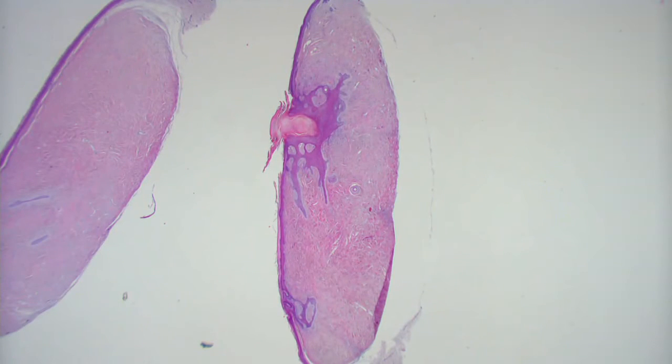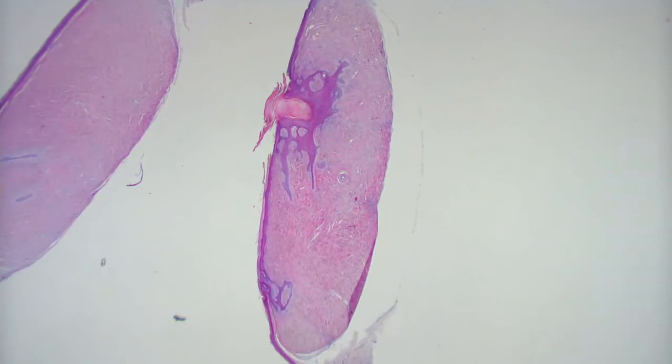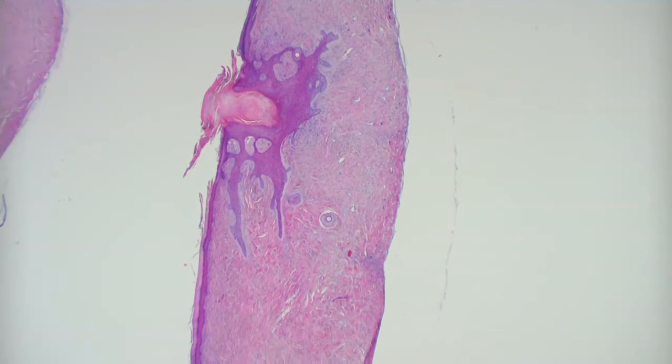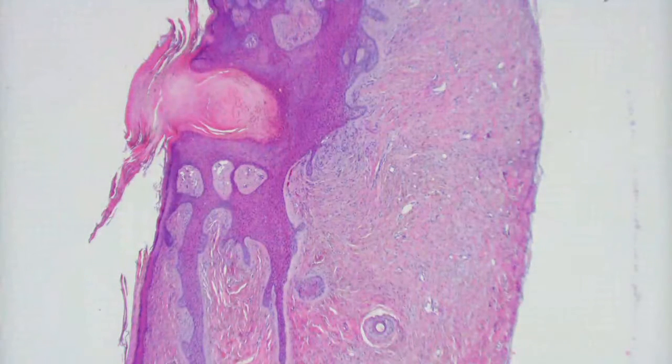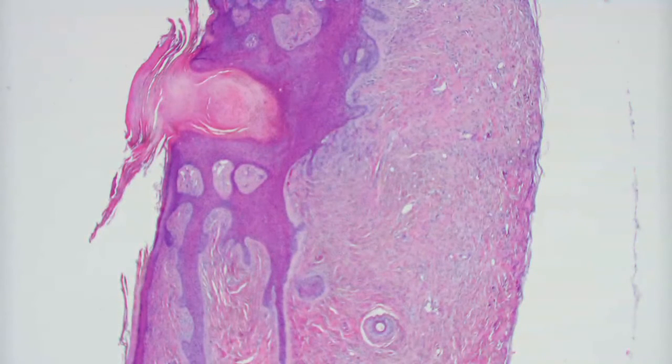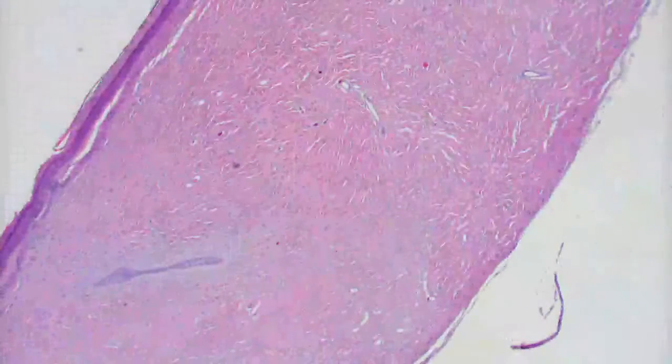So, you guys have already seen these, right? Yes, sir. Good. All right, anybody want to give a quick description of this lesion? I can start. This is a shave of a papule. There's a pretty well circumscribed proliferation taking up most of the biopsy in the dermis that looks kind of spindled. There's an overlying basaloid induction at both ends. One thing I thought of that does that is a DF, but I didn't see good peripheral collagen trapping, and I don't think I've ever seen a DF that's really circumscribed or almost pseudo-encapsulated like this. But it was a thought.